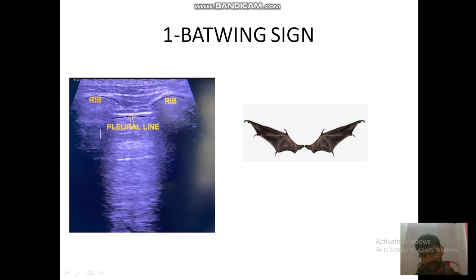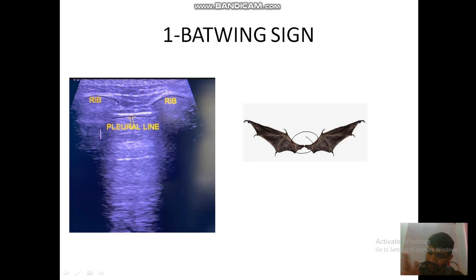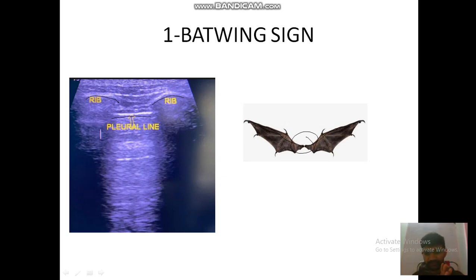The combination of the two ribs and the parietal pleura forms the batwing sign. Why do we call it a batwing? Because the hyperechoic white lines formed by the ribs pertain to the wings of a bat, and the pleural line pertains to the body of a bat. So we call it the batwing sign. This indicates a normal lung. Remember, whenever you study a sign, you need to know where you see it, which probe is used, and what conditions are used.